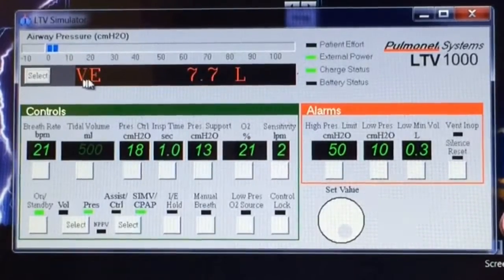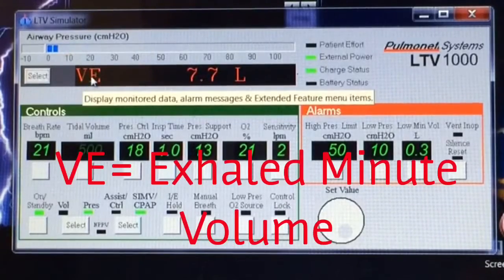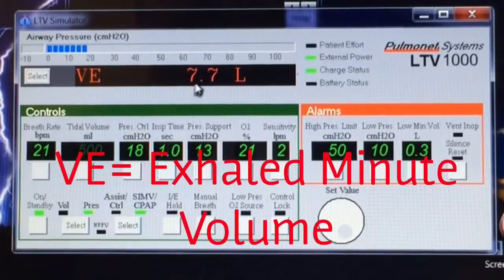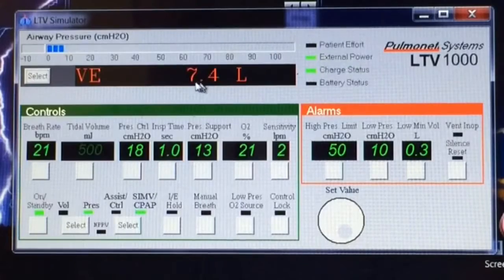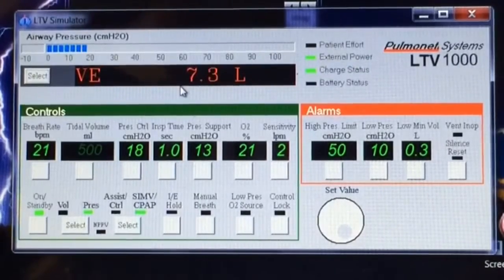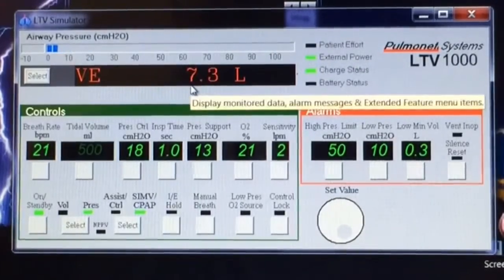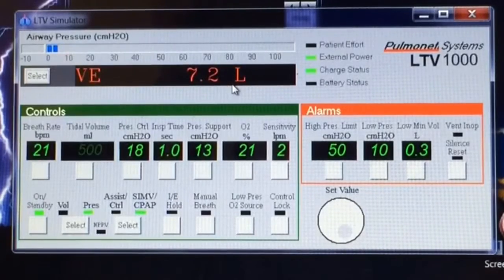Click it again, and VE is the exhaled minute volume. That's how much air went in and out of their lungs during the previous minute — it's all of the volume from all those breaths added up together, and in this case it's 7.2 liters.